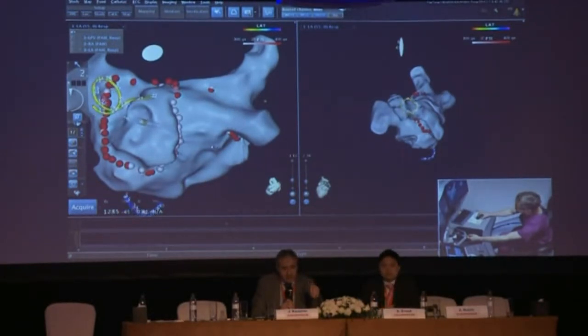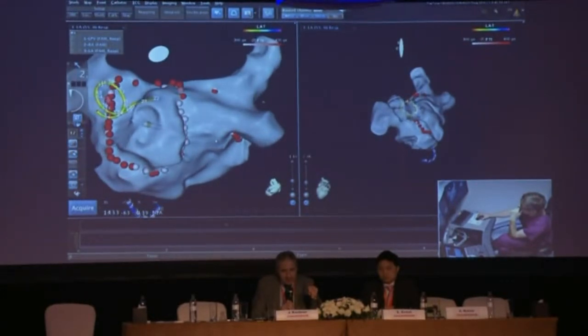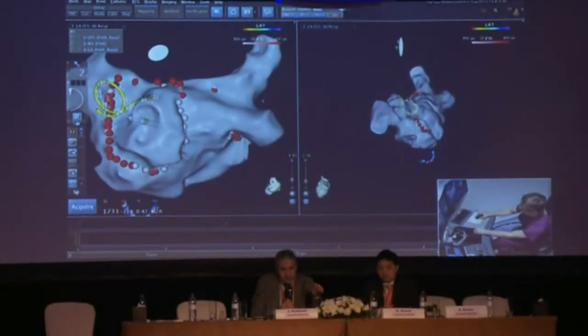Even if you do a mitral isthmus line, you have to finish sometimes within this area with a substantial effort, because it could be a very thick area. The amount of tissue is very big, and there is the Marshall vein, sometimes quite big, so there is a lot of tissue that has to be ablated.